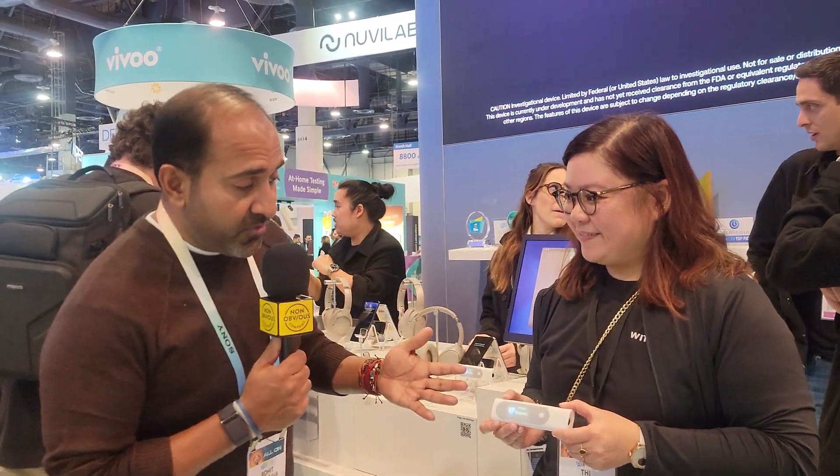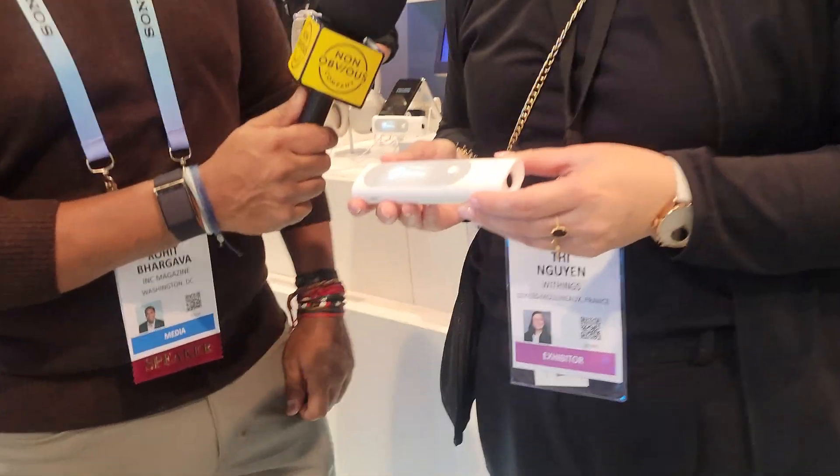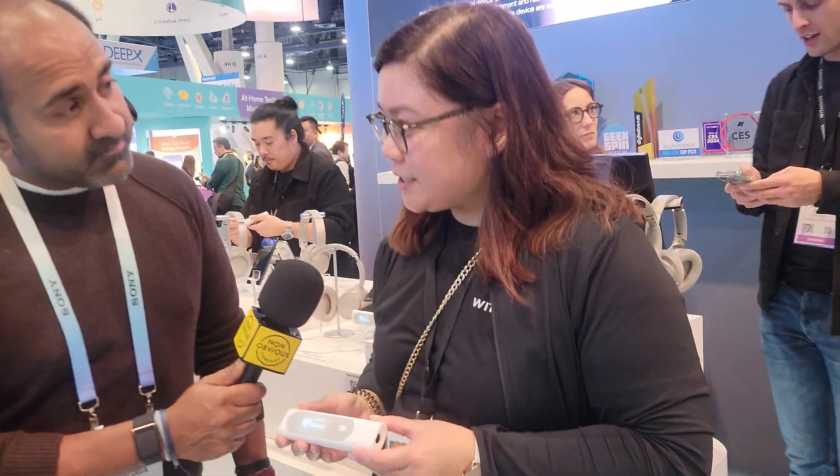We're here at the Withings booth and they have all sorts of biomonitoring devices for health. This one is the newest one that just came out — it's called the BMO. BMO is a multiscope allowing at-home health check-up, and you have four different measurements.